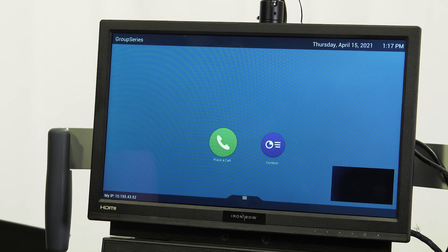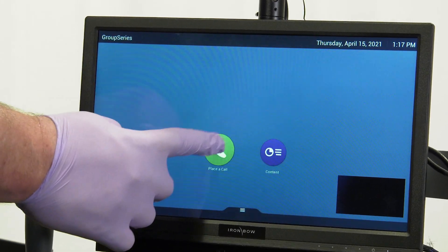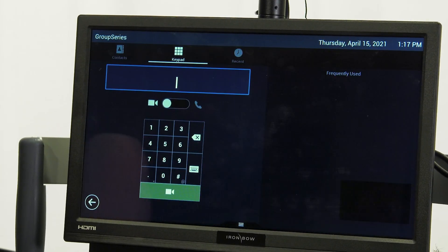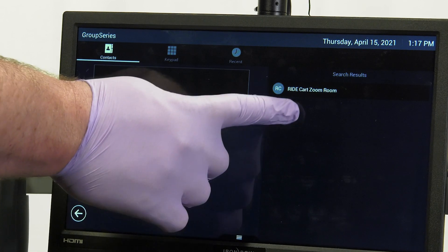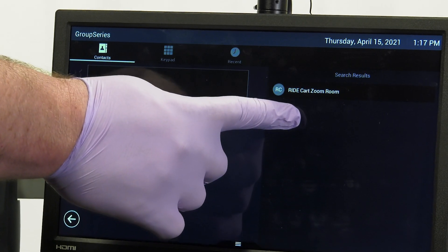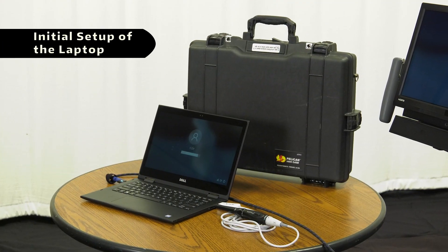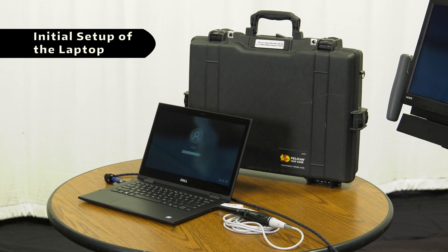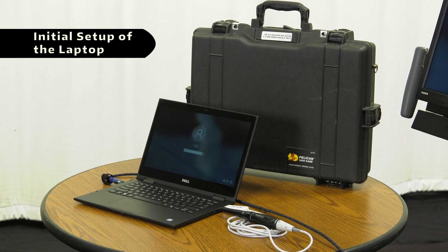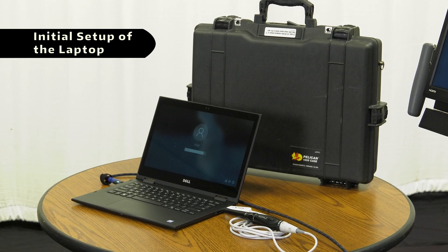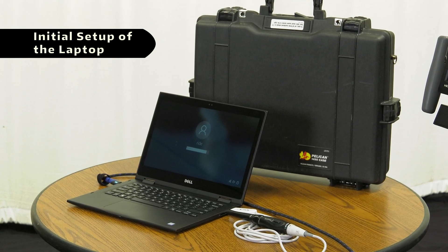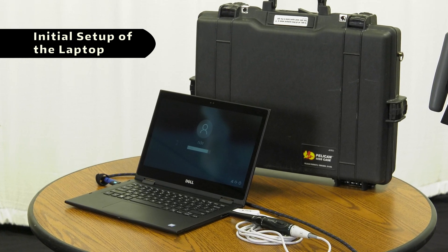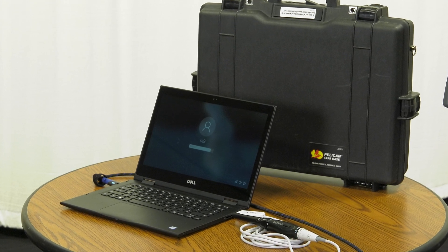Confirm that the dial numbers appear correctly on the Polycom unit by pressing Place a Call, then Contacts. Out of the case, the laptop is set to Factory Defaults. Your institution's IT department can re-image the laptop to cater to your site's preferences, if desired.